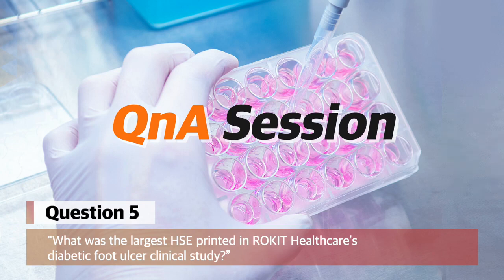For example, doctor in vivo could possibly print at one time 10 centimeter by 10 centimeter. That's why I also try to treat the diabetic ulcer patient with that kind of larger size. So while I would like to answer that you can actually print 10 centimeter by 10 centimeter, I understand that most researchers who use artificial skin models for toxicological tests don't necessarily print that big an artificial skin model because of the amount of cells.